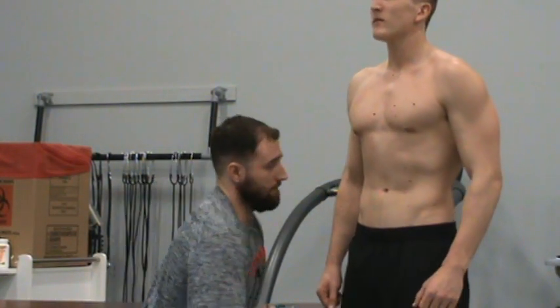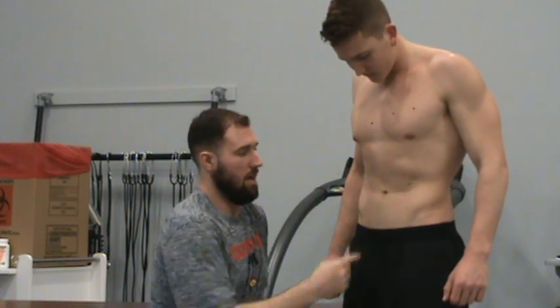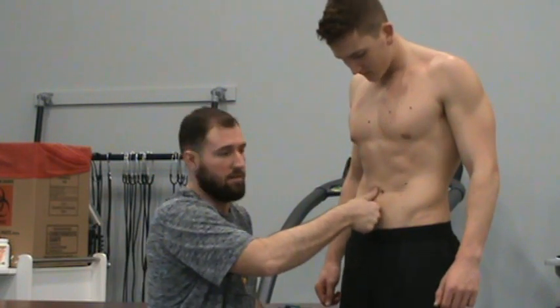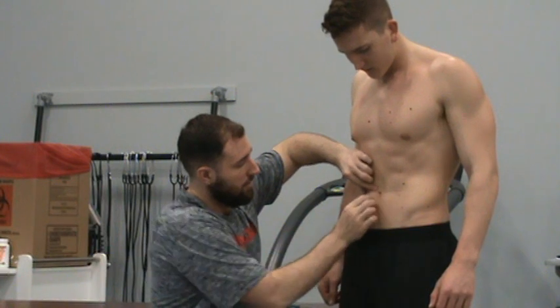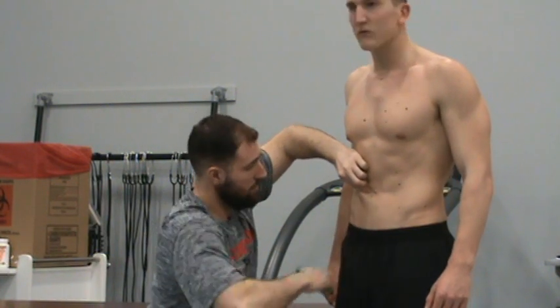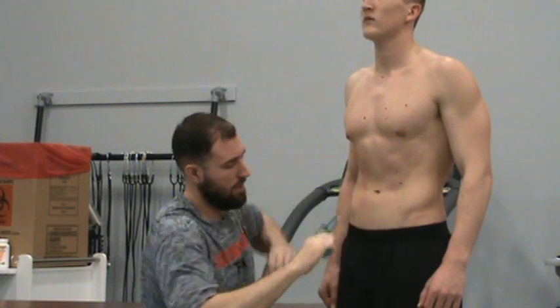Then I'm going to the abdomen. We just want to find the belly button, and I'm going about one or two centimeters out from that to his right side. I just use about a thumb's width here. Back to a vertical fold, caliper just under my thumb, and I get a 16.